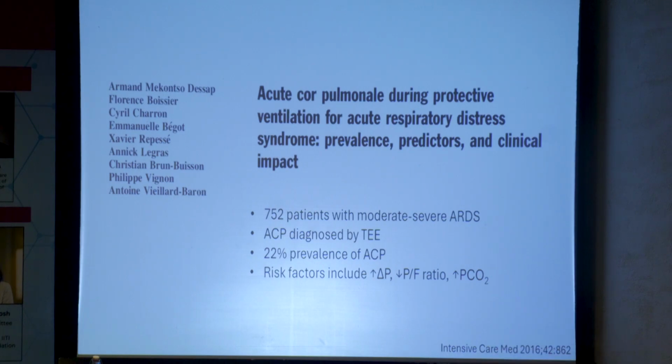You had mentioned regarding use of the same for hypercarbia. You said less than a handful of patients have been done. How do you compare the indication, because we have other extracorporeal mechanisms for CO2 removal? So is the indication when there is a refractory indication to the extracorporeal removal, or is it because it is associated with hypoxia as well?